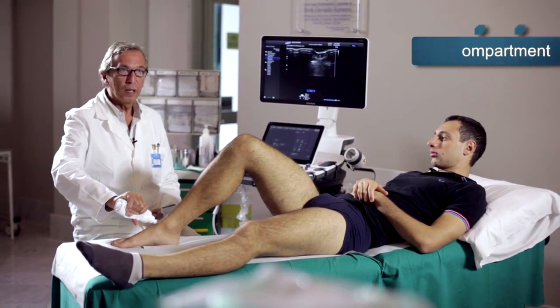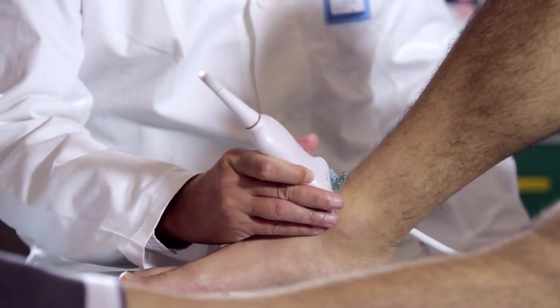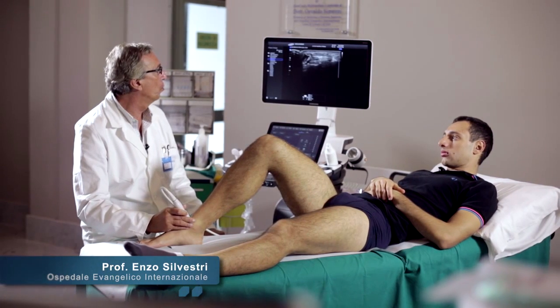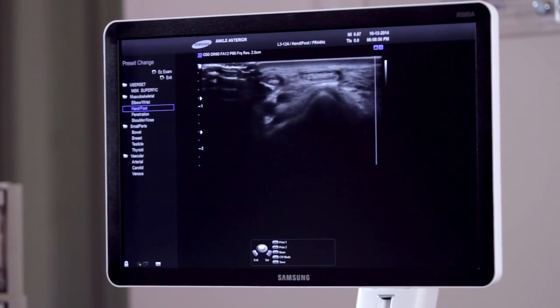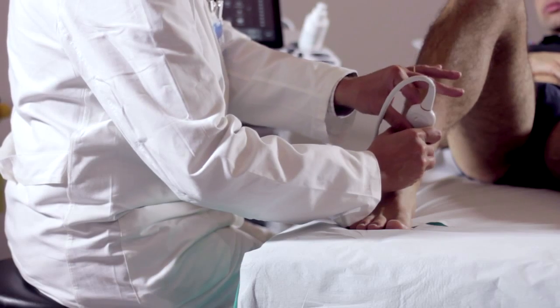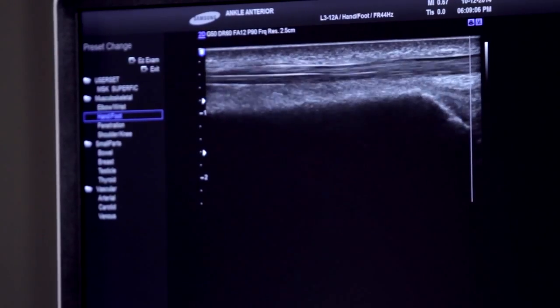We now move to the anterior compartment of the ankle and study some of the most important tendinous components. We start with axial scans on the side to see the anterior tibial tendon. This tendon is the most voluminous of the anterior compartment, and it is well highlighted along the short axis as we see on the screen. And it can be studied by rotating the transducer clockwise by 90 degrees in its longitudinal extension.